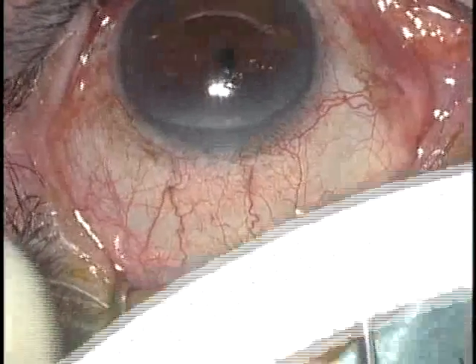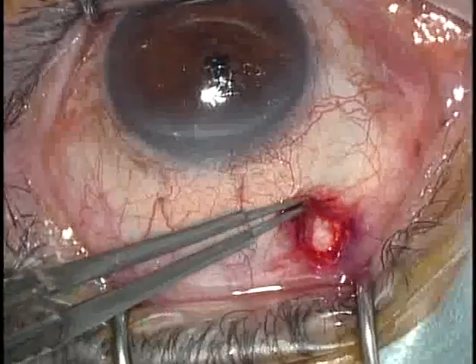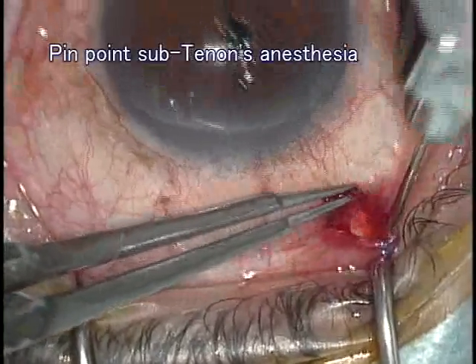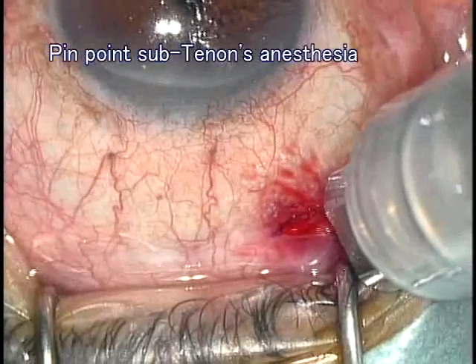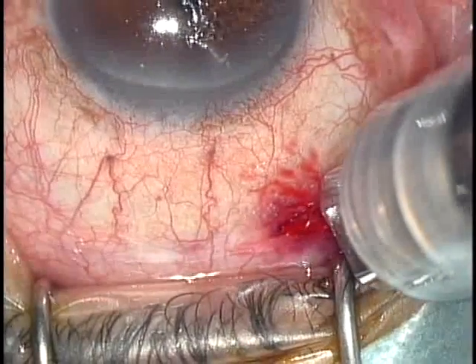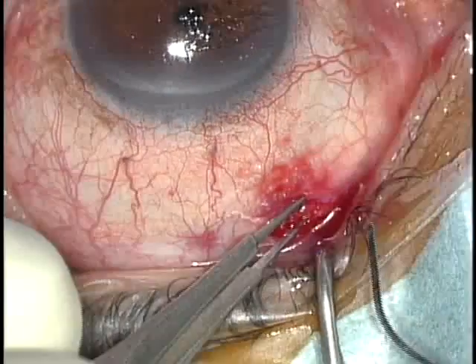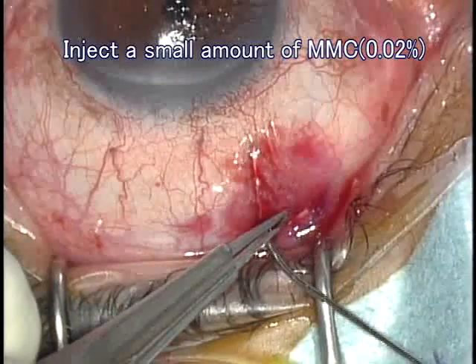I first demonstrate small incision trabeculectomy through a 3mm conjunctival and Tenon's incision. It is 8mm from the limbus posteriorly.